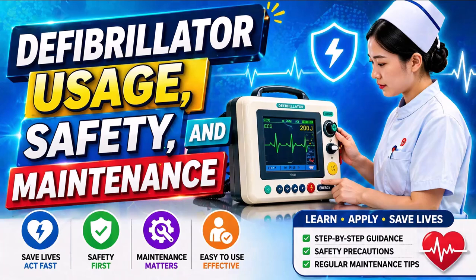Human factors also play a role in defibrillator-related incidents. Incorrect energy selection, poor electrode placement, or misunderstanding device prompts can lead to ineffective treatment. Technicians may assist by providing training, user guidance, and clear labeling of devices.